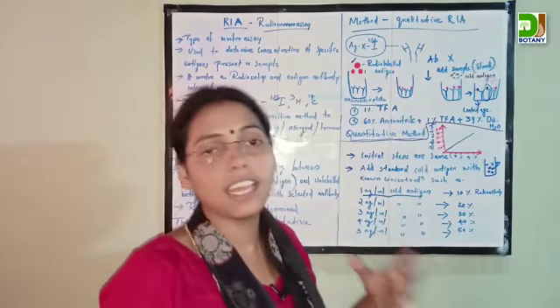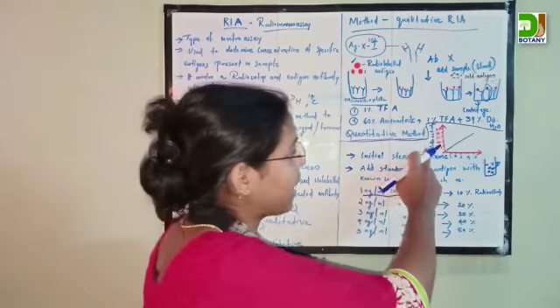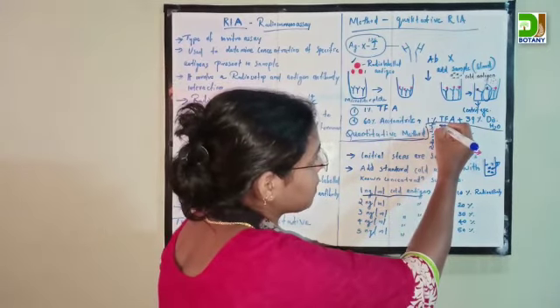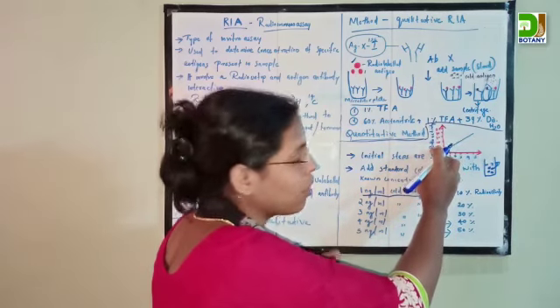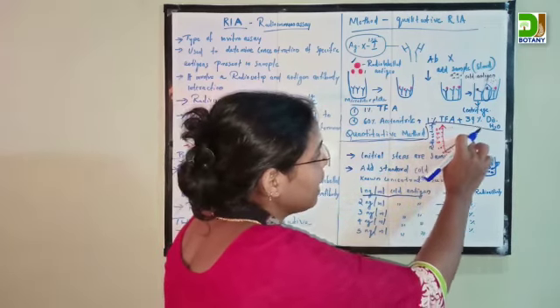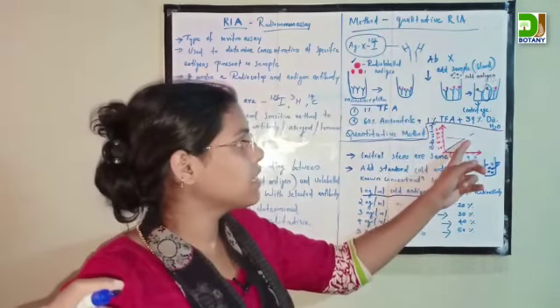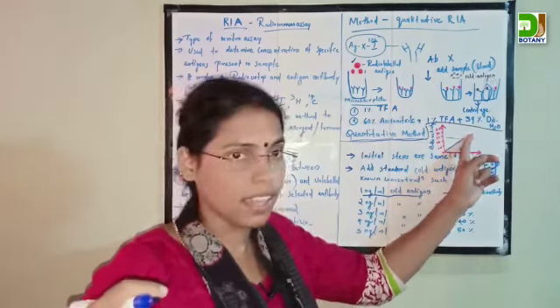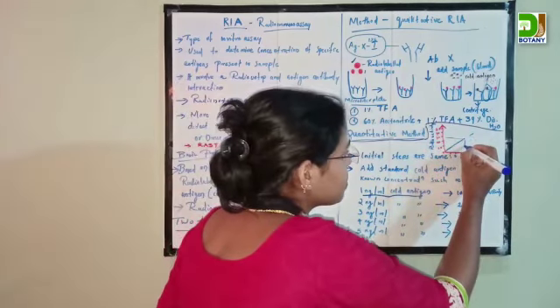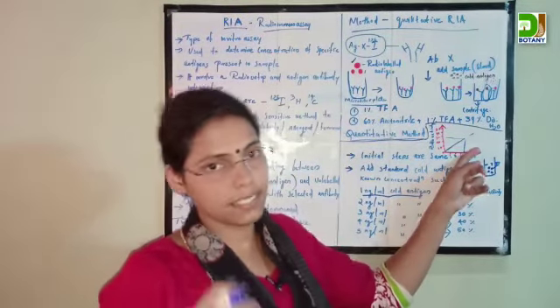We measure the radioactivity and get a specific value. This axis represents the radioactivity. For any radioactivity measurement, we draw a line toward the standard graph until it touches a single point, and then we get the concentration of the test solution. So this is the quantitative method.